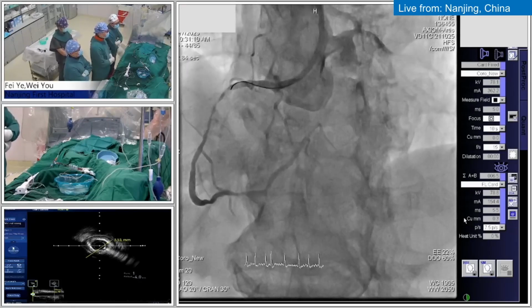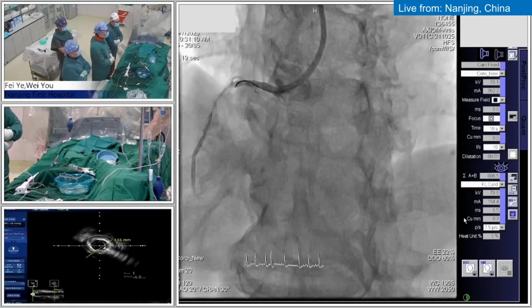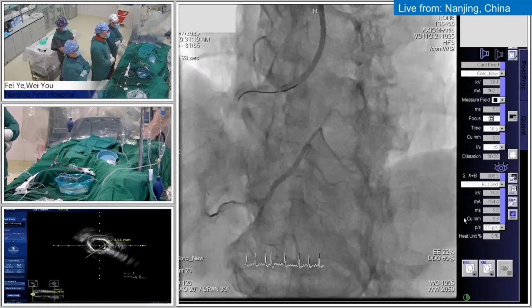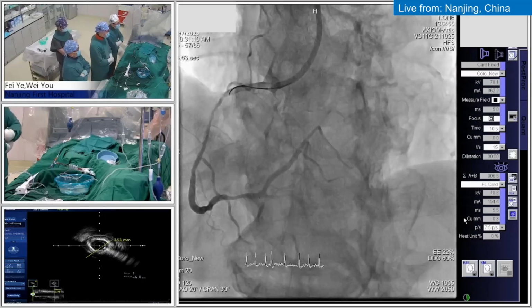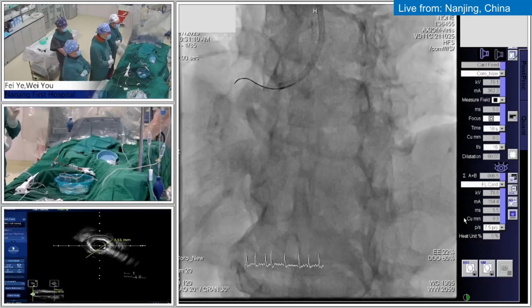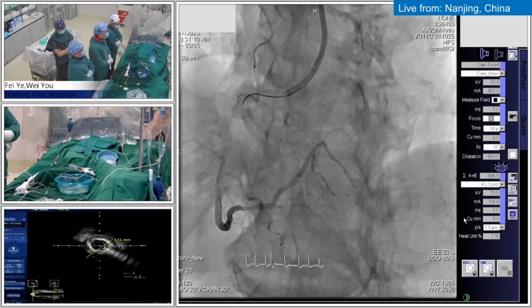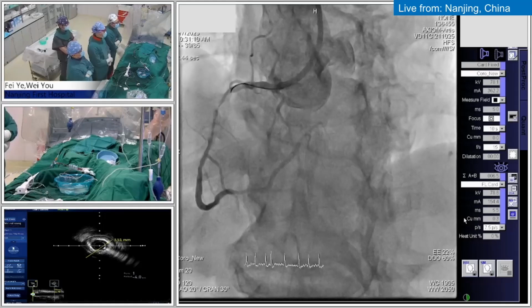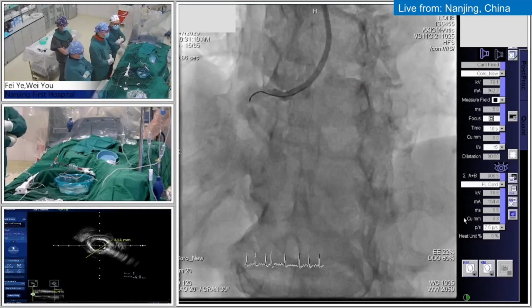Although we don't have Impella in the Chinese market, we have ECMO here, but the patient has multi-organ disease. I don't think ECMO is our initial choice. So today, our PCI strategy, we just want to PCI the RCA. And for the RCA, we just use IABP standby. I think that's enough. Before that, please show me the LAO cranial view, please.